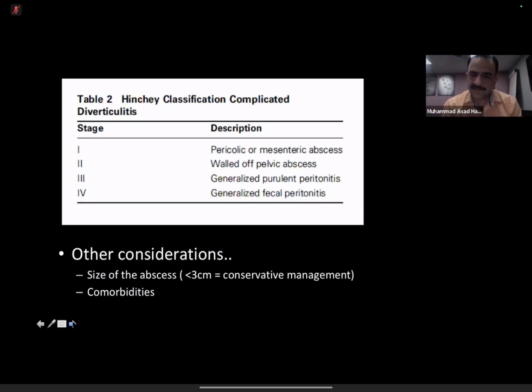But on the other hand, the patient has so many comorbidities that giving a GA might be detrimental. In that case, interventional radiology comes to the fore, and you need image-guided drainage. Drainage, as described by the previous candidate: Seldinger technique, drain size. Those are things the examiner tends to ask about.